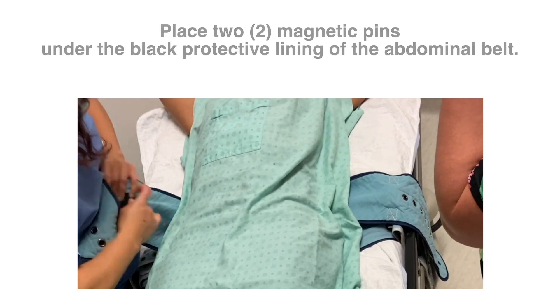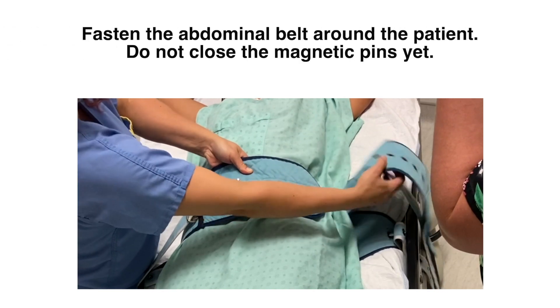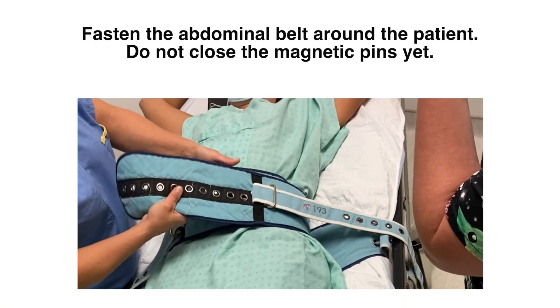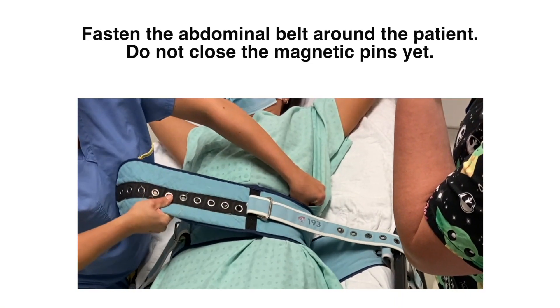It is important to leave one eyelet free between the two magnetic pins. Fasten the abdominal belt around the patient. However, do not close the magnetic pins yet.